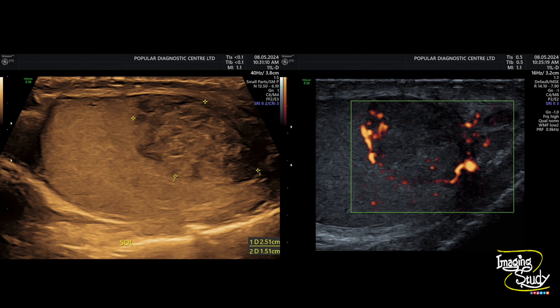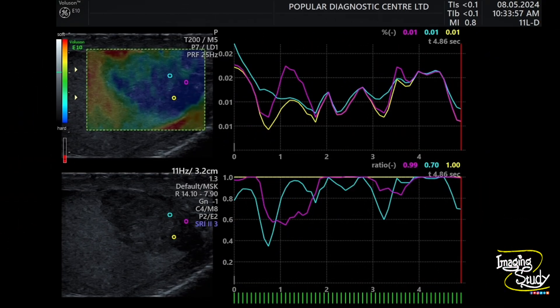Here's the picture with an approximate measurement of the lesion, and on the right you can see the prominent peripheral vascularity on power Doppler. We have also assessed the lesion with elastography, and it suggests the lesion to be hard in nature.